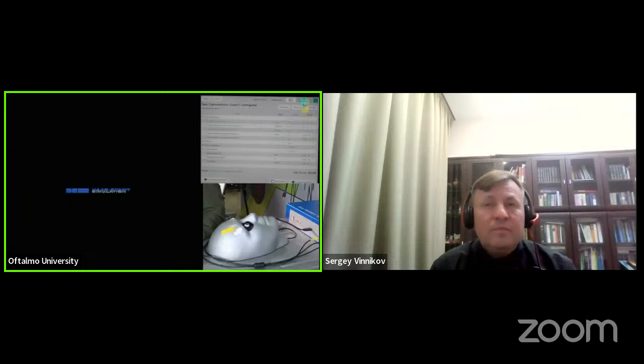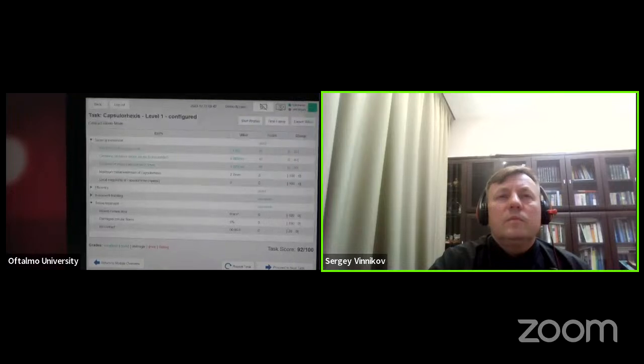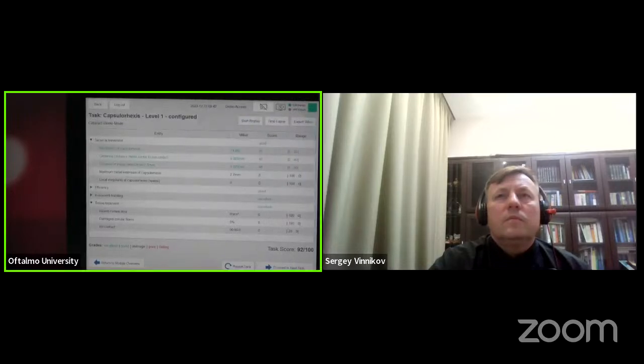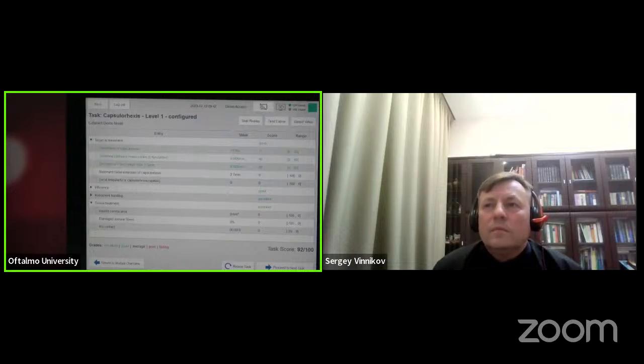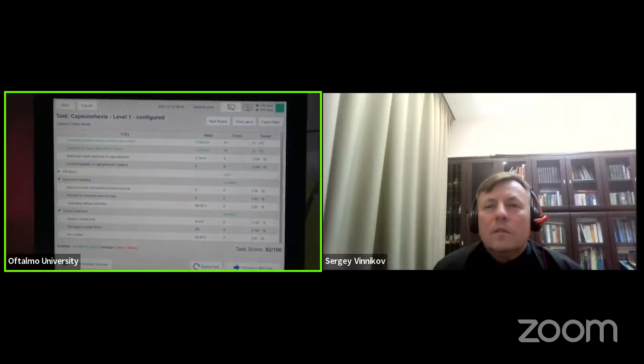Look at there, we're going to make it big, but look how important it is to see if your rhexis is round, if your rhexis is centered, if the deviation of the radius is correct. So in this case, he had a 92. He was perfect in order to make the target work. He managed the instruments. Most of all, he didn't damage any other structure like cornea, fibers, or iris.